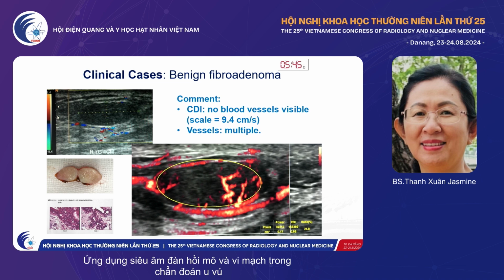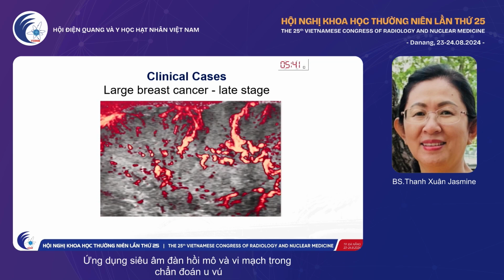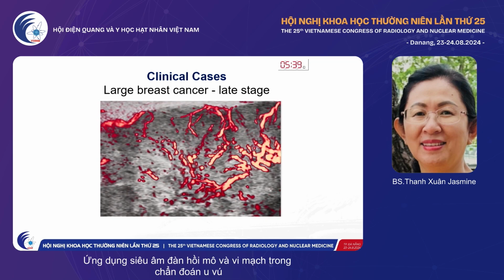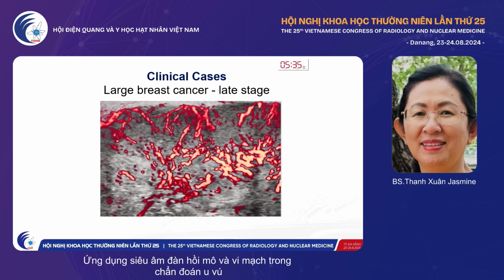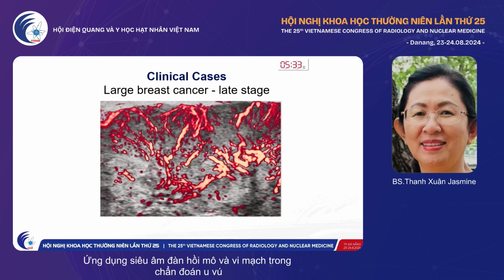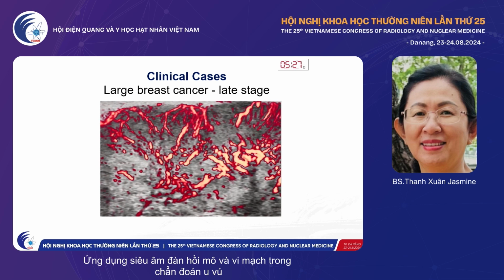This is a large breast cancer in the late stage. We made it with microvascular flow from Samsung company. And we can see intense vascular proliferation in the tumor in this large breast cancer at late stage. You can see it.